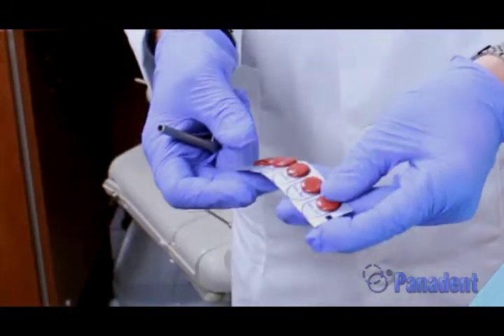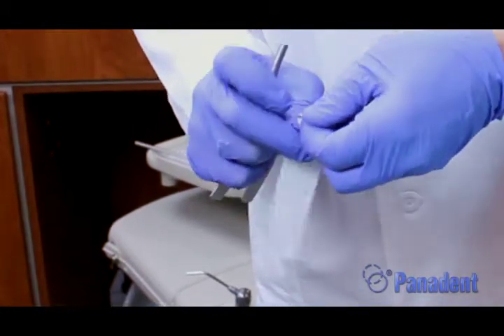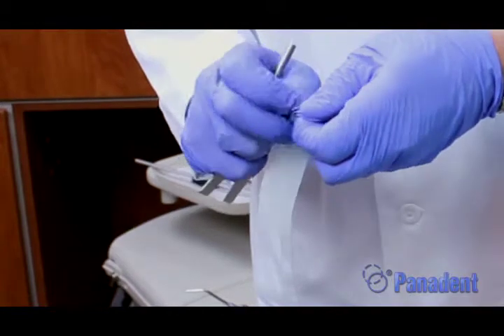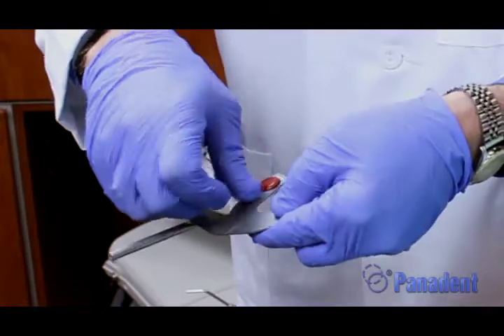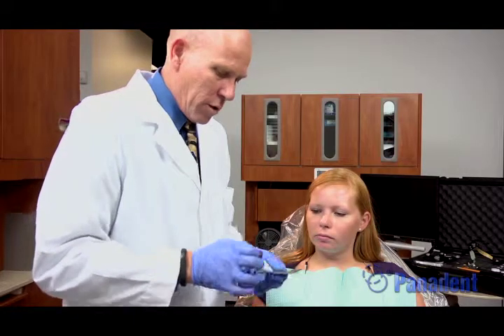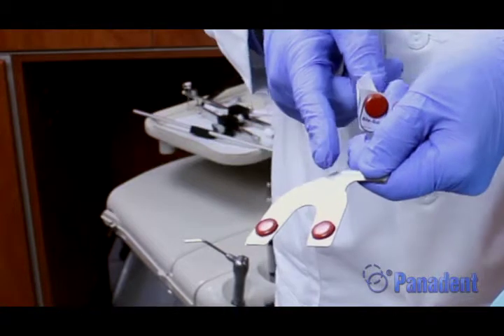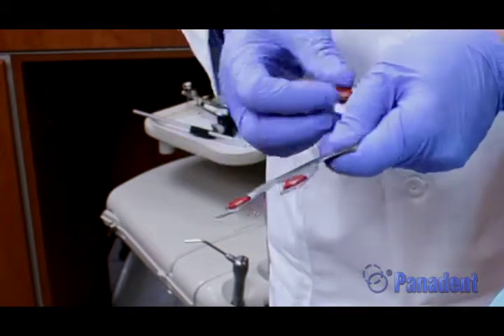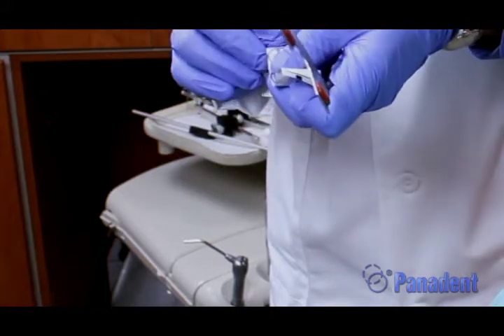We'll go ahead and do the bite fork registration here first. We do have our bite tabs, which is a red impression compound on a self-adhesive strip. We can bend this back and peel off one of these bite tabs. We place that onto the posterior molar area on both sides of the bite fork, and another one on the other molar side. There is a little dental midline mark on the bite fork, so I'm going to put the third one sideways in the incisor area so I don't cover up that dental midline mark.